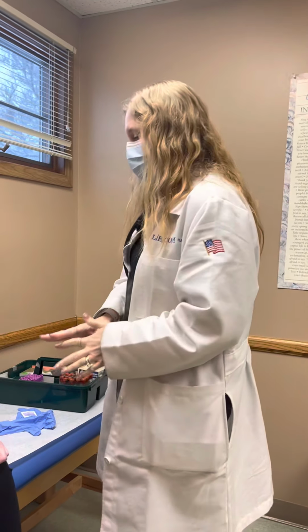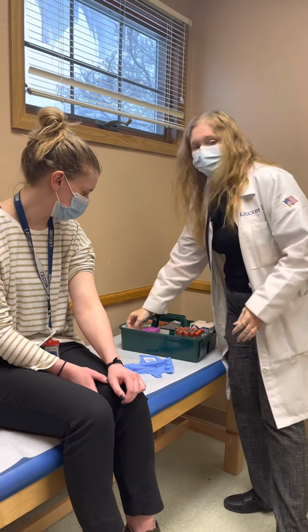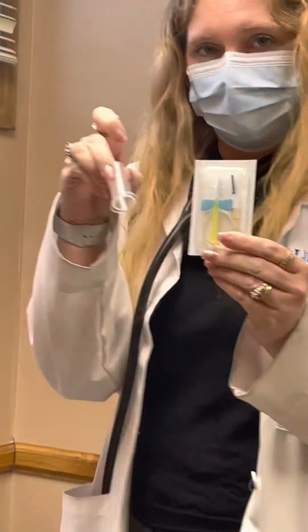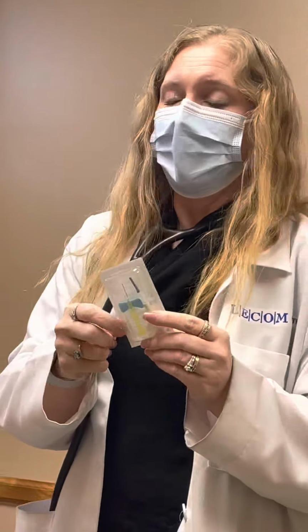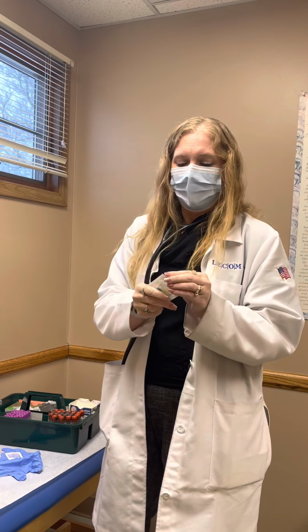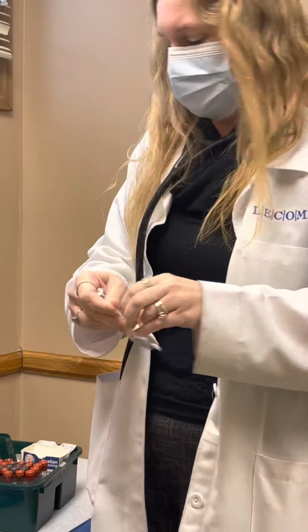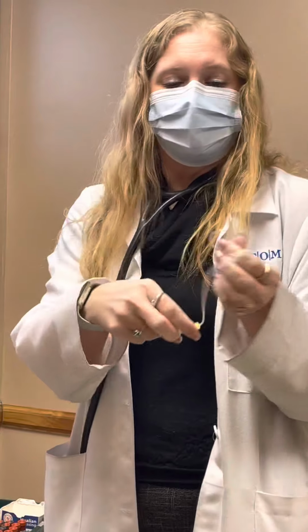So the first thing whenever you're drawing blood is you want to assemble your equipment. What you guys are going to use are butterfly needles. So this is a butterfly needle, and this is the vacutainer. You don't want to walk in the room and be fumbling around with someone with a tourniquet on their arm. When you open this up, you're going to see a little plastic sleeve over it. Remove that plastic sleeve and straighten it out.